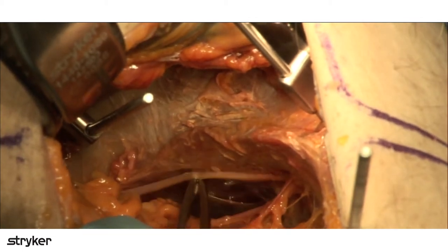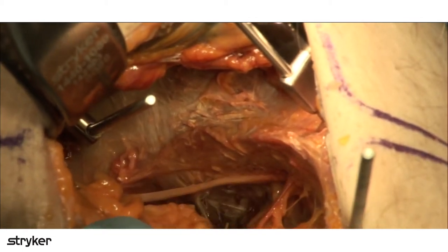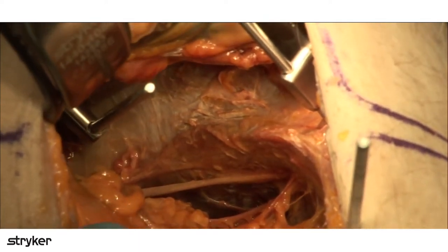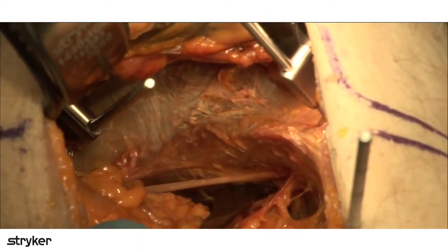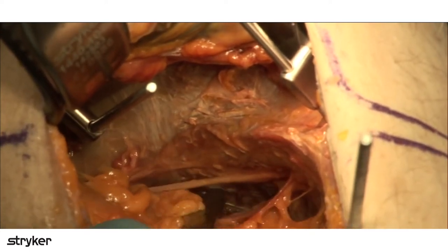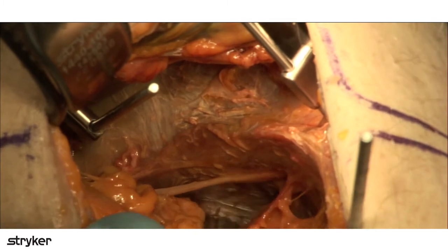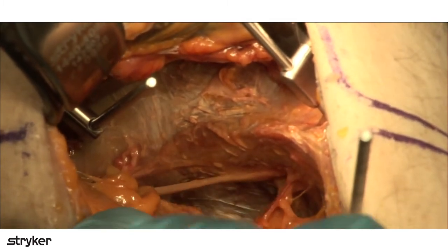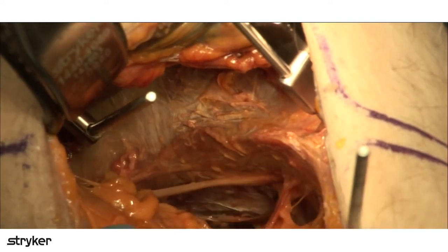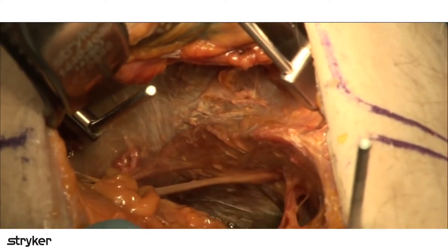So I'm going to want to come in underneath, and I'm going to work down here now. So that's why it's really important and critical that you release the nerve well, because now I can dissect with impunity along the medial surface of the posterior column and the quadrilateral surface without doing anything to the obturator nerve.